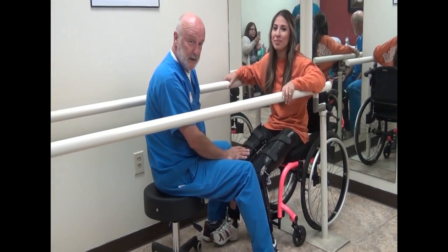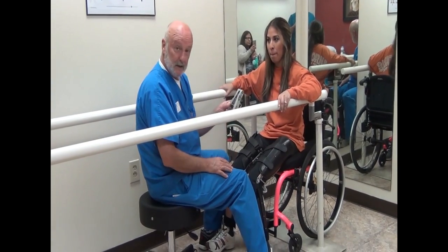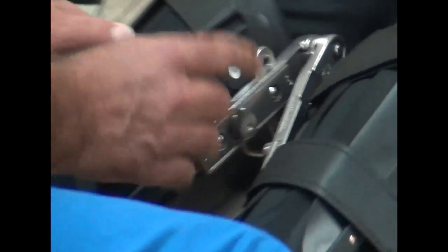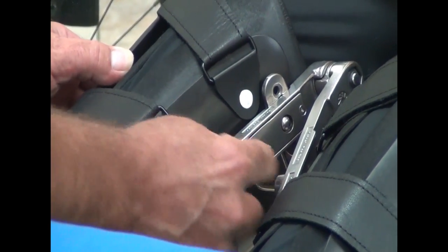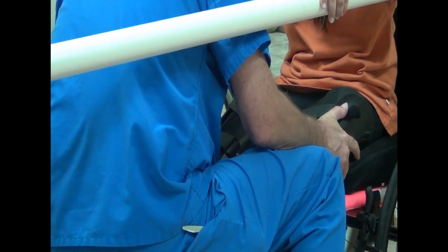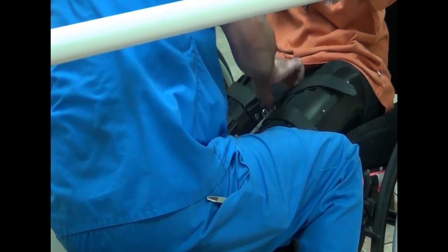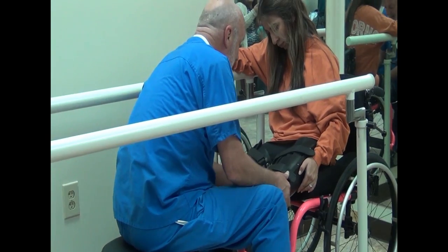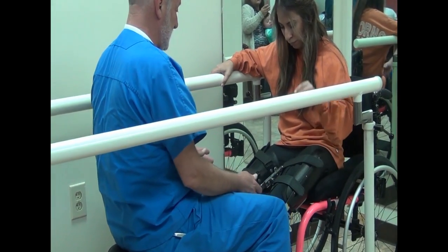This is Joanna, and we've just put her KFOs on and are getting ready to lock the device in place. She'll attach one side, rotate this, and that will pop in and lock in place. The other side's a little more tricky — you've got to kind of line it up and get everything in there tight. The top is always a little tricky, so I reached in and squeezed so it's locked in, then twist that. Always make sure you twist that so that it works.